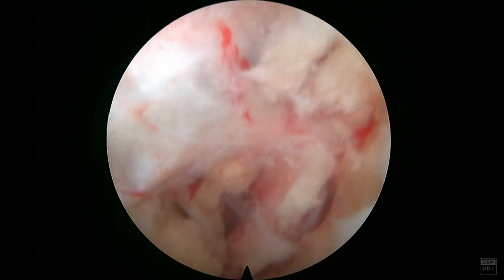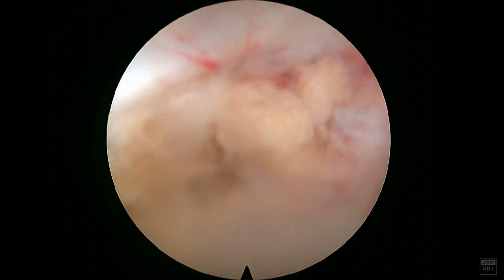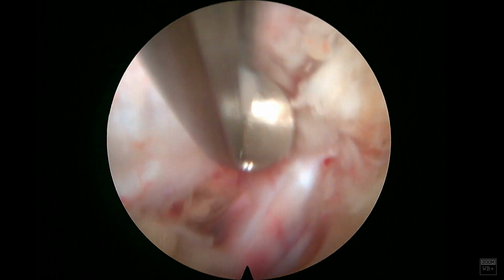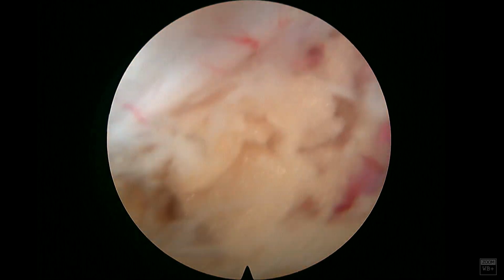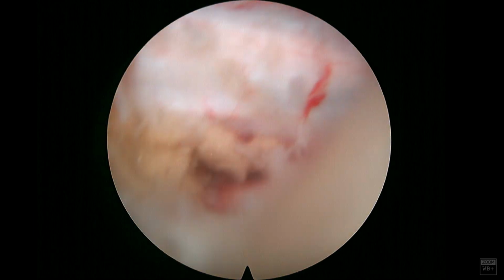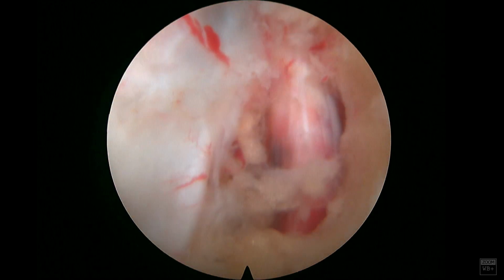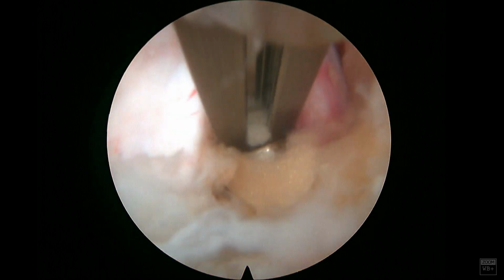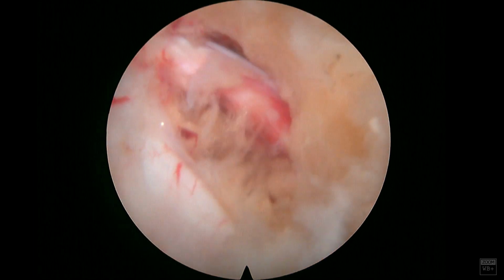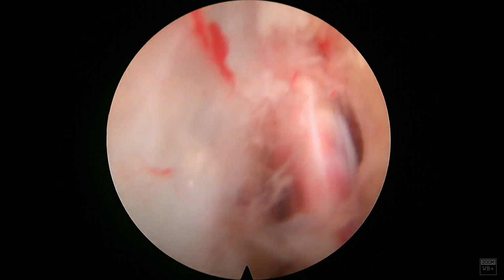Again, the L5 nerve root is very tenuous, just like the C5 nerve root in the cervical spine, so you have to really be careful to not ding this nerve up too much. So I'm really cautious of the Kerrison when I'm taking these bites. You can see that nerve is irritated kind of circumferentially, and so I believe the stretch of the spondylolisthesis does cause some of this irritation, but I think it's really the compression against the bone and that osteophyte that causes it. So we can see here that the nerve is probably adequately decompressed at this time. I'll remove that kind of caudal lip there that it's still traversing under, but you can see there that that's a good view of really the impingement of that bone onto that nerve root.